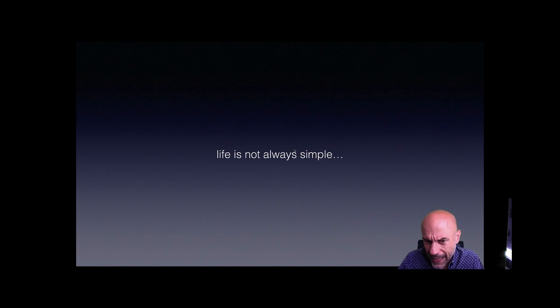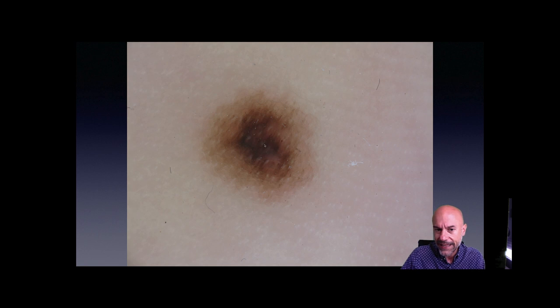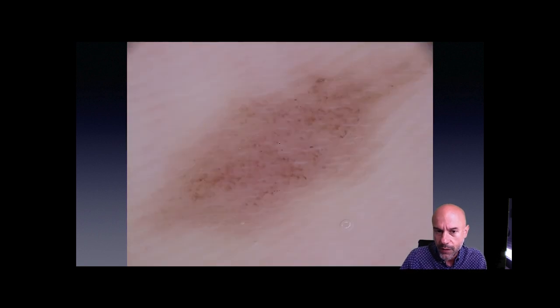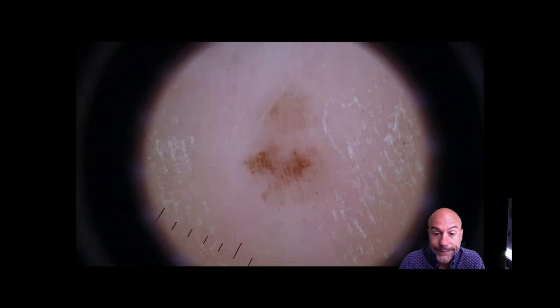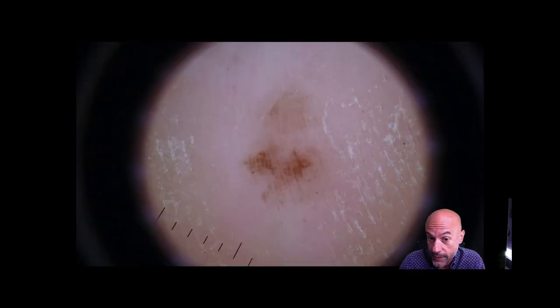But sometimes, as I said, it's not possible to answer the question furrows or ridges — like in this lesion here or in the next one. Furrows or ridges? I'm not sure. I cannot say. Furrows or ridges? I'm not sure. I cannot say.